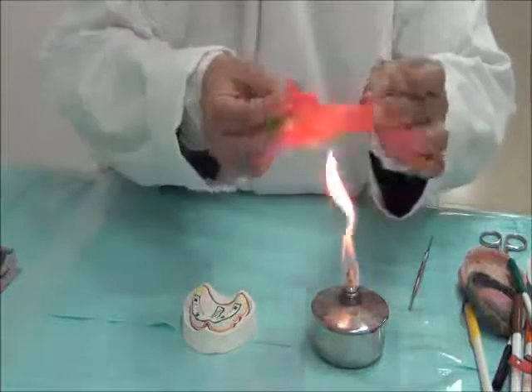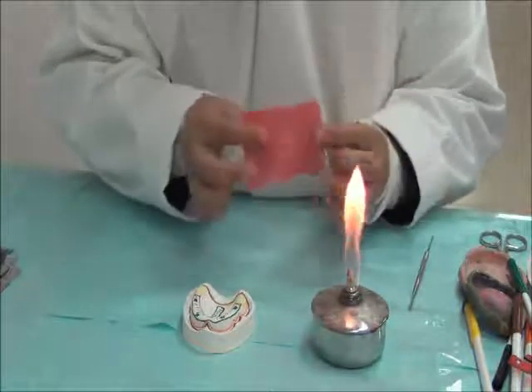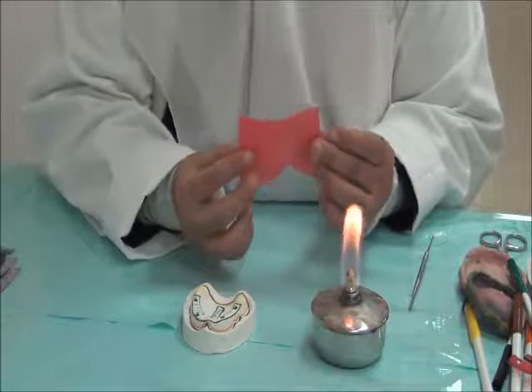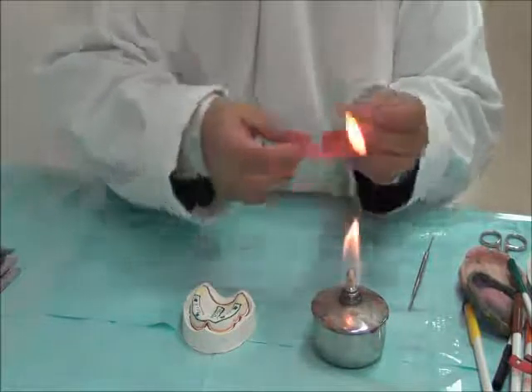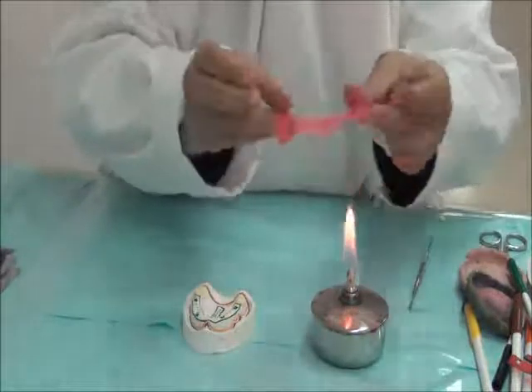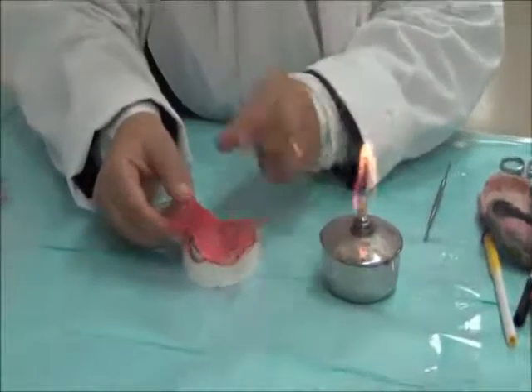Going in on the temperature heats the surface. When we go out, we allow sufficient time for the heat to diffuse to the inside. Wax is not a good thermally conductive material, so we need time for the heat to diffuse from the surface to the inside. So we heat it gradually. This is called tempering, using dry flame. And once it's soft enough, we just put it on the cast and begin adapting it.